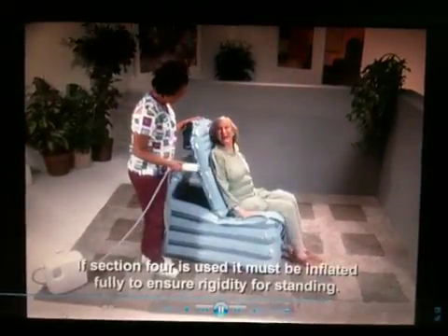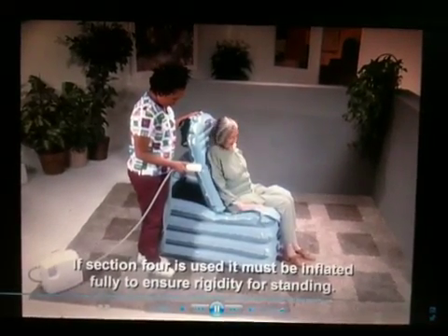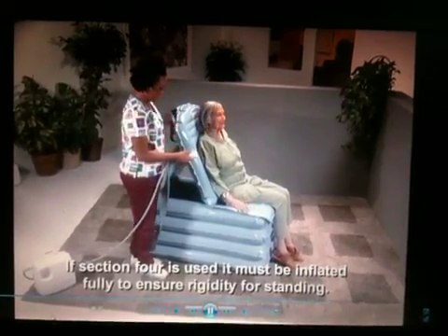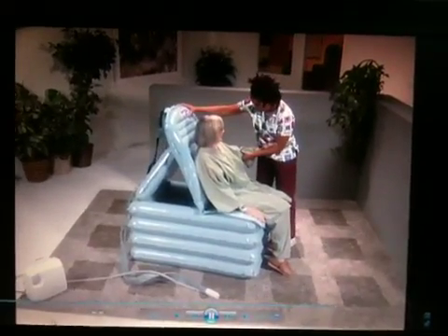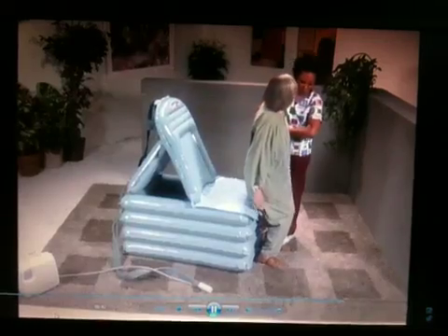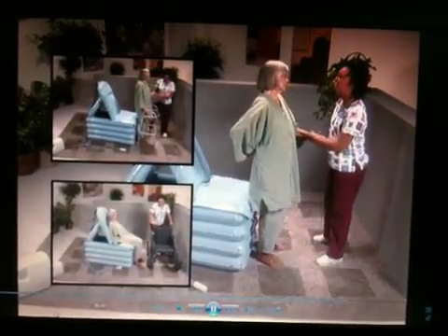The caregiver should make sure that the person's feet and knees are properly aligned. Before attempting to stand or transfer, the backrest, button number 1, must be fully inflated. The caregiver will need to assess options for standing or transfer. The person may simply stand up and walk away, stand with the assistance of a walker, or transfer to a chair or wheelchair.